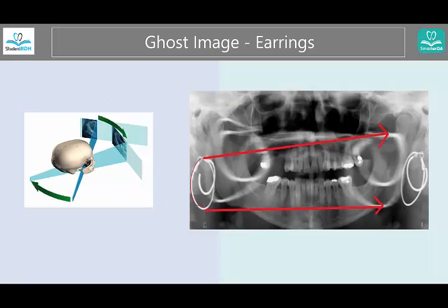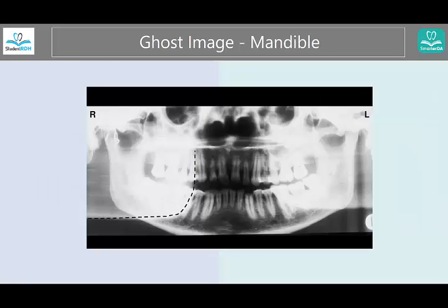Here you have the real earring and this is the big ghost image — again higher up, blurry, and on the opposite side. This hoop earring is a little different because it's taken from many different angles, so sometimes it might not look like an earring. It might look like a straight line depending on the angle.